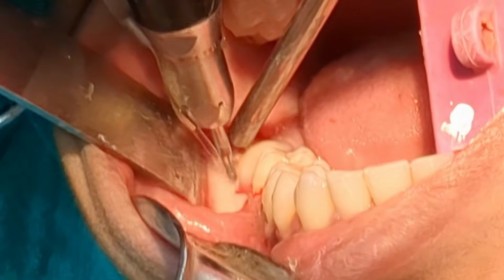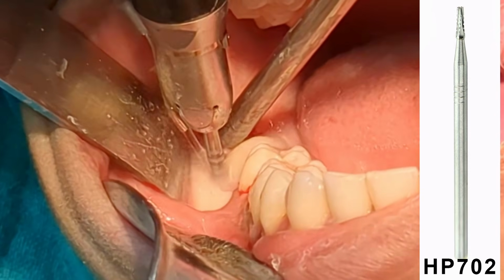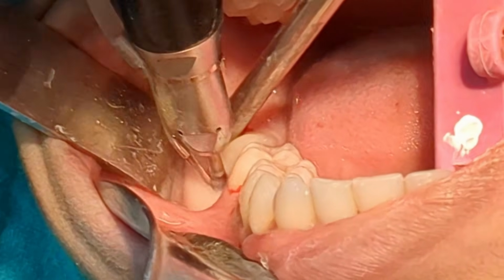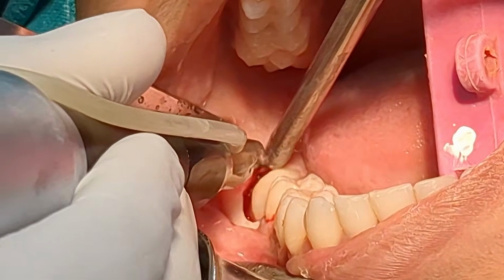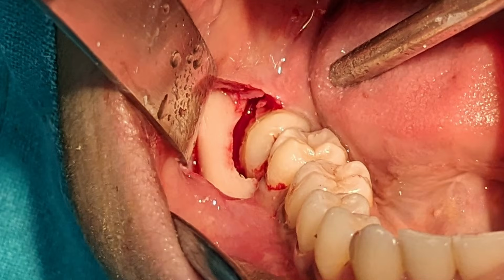I connect those ditches with an HP702 straight burr to create a bone gutter buccal and distal to the tooth. This is how the bone gutter looks.